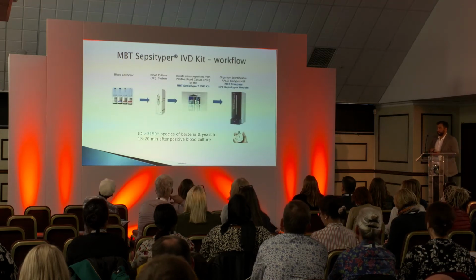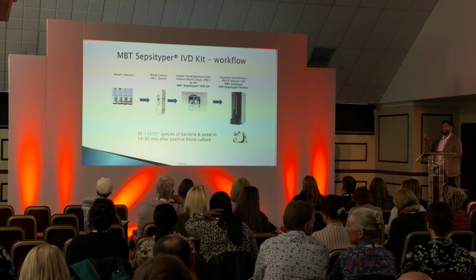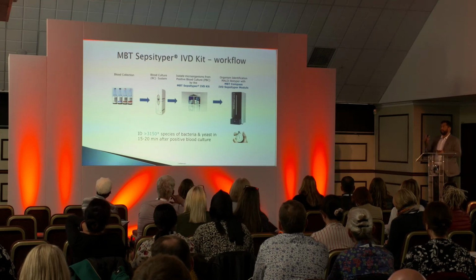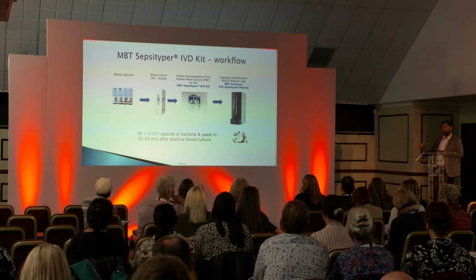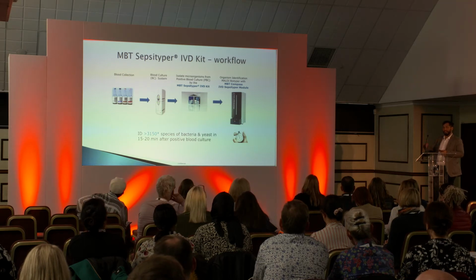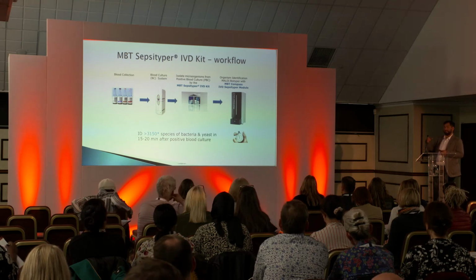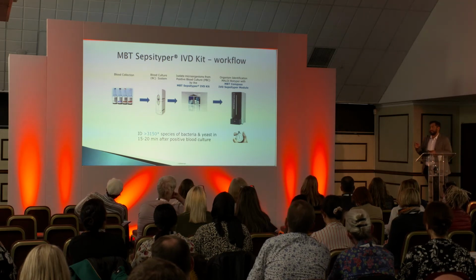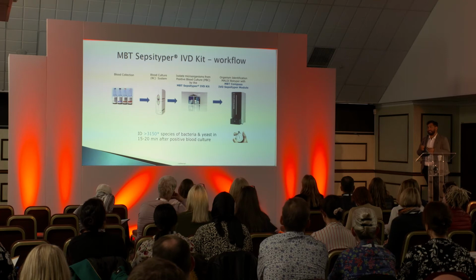This is a little bit of the workflow that I've already described. There's the blood collection. It goes on to a blood culture system where it's incubated and rocked, and if there are any pathogens present, they will grow. In our laboratory, if it flags up positive, we then do a Sepsityper, but only if it's a new blood culture. If the patient had one positive within the last week, we would probably leave it and rely on the gram stain unless it was something different. But for all new patients who've had a new blood culture flag up positive, we will do this Sepsityper to get that preliminary ID, and then that goes on to the Maldi-TOF. So again, we get a positive result, an ID or preliminary ID, within 15 to 20 minutes of it flagging positive, which is quite significant.